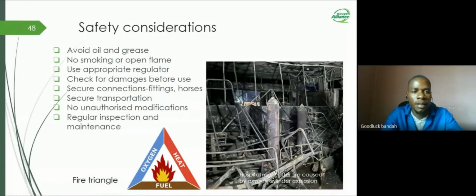Make checks before using your cylinders. And also make secure connections on the cylinders, as already said. Whenever transporting, transport them securely. And please don't do unauthorized modification on the cylinders. Don't do any unauthorized modification, because that will create chances of explosion or leakages. And it's so important that we regularly inspect and do maintenance on the cylinders to avoid these uncertainties.